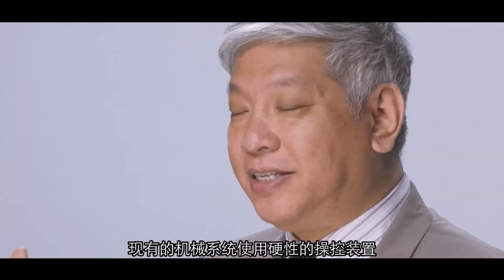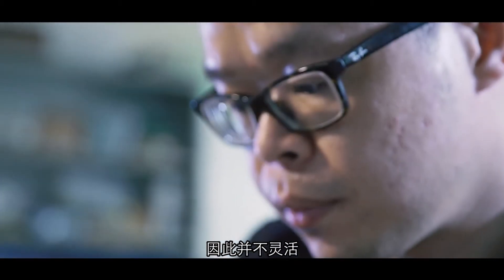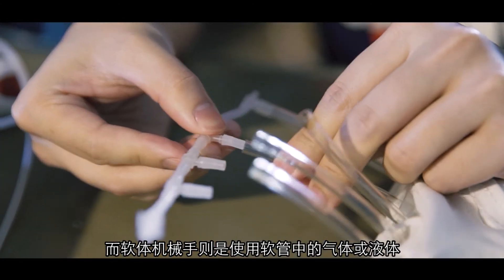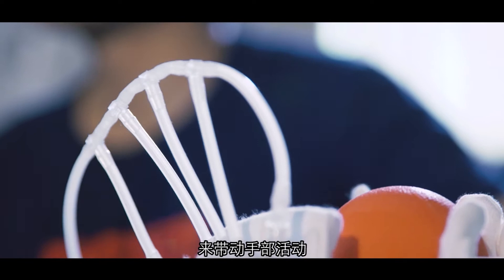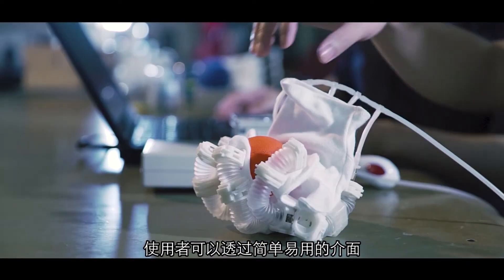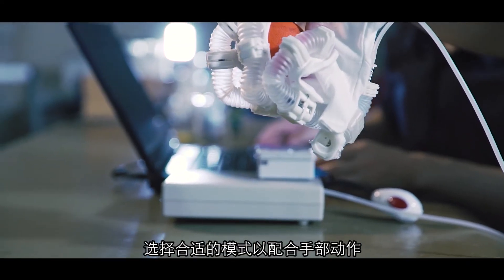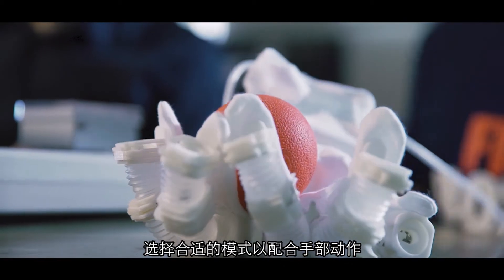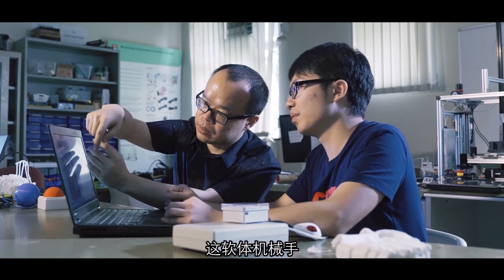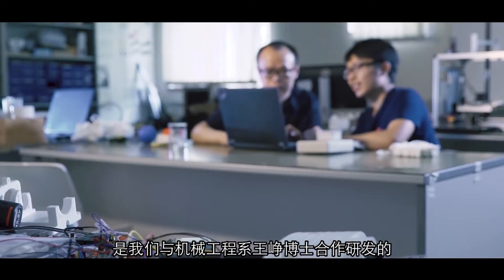The existing robotic system uses rigid control which is not flexible, but the soft robotic hand uses gas or fluid by a tube to make hand motion. The advantage of the soft robotic hand is a friendly interface that adapts your motion and follows the intention of the subject. We developed this soft robotic hand in the lab of Dr. Wang Zhen from Mechanical Engineering.